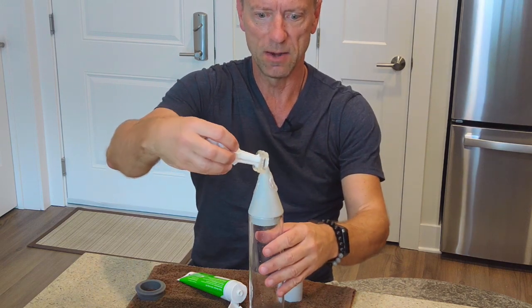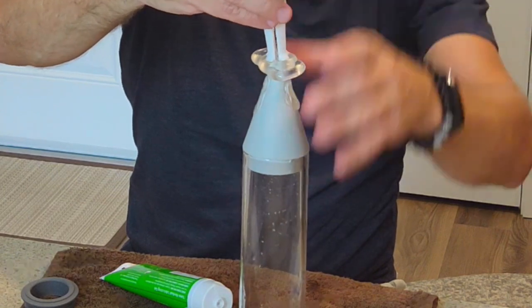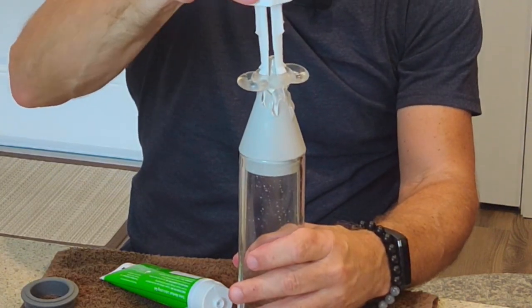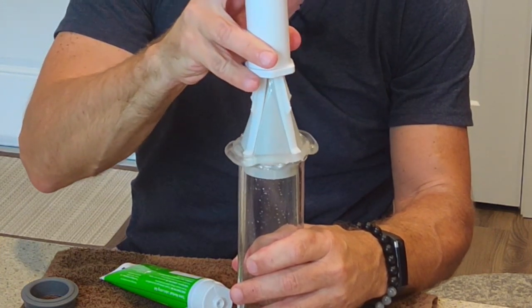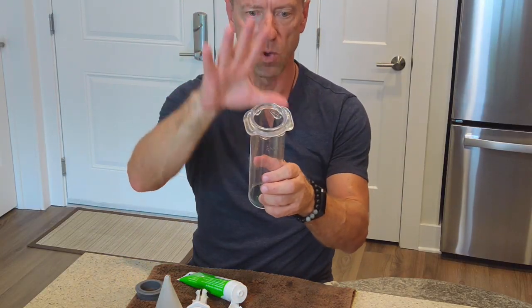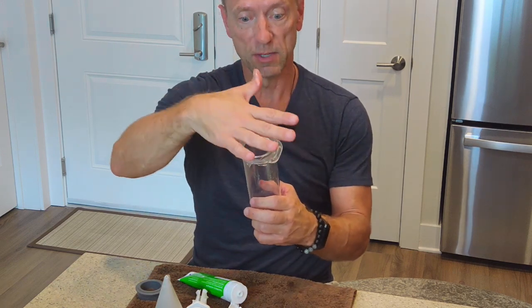So I want to get this here, and then I'm going to put this here. I want to take this and create a little bit more leverage for myself as I do this, and hopefully you'll be able to see that, but I'm just going to then drive straight down onto there. And then I pull this away. So the more you do it, the more comfortable you get with it. You can see that I'm well lubricated here on the cylinder, and then again, I'm able to transfer this easily from the cylinder onto the body.